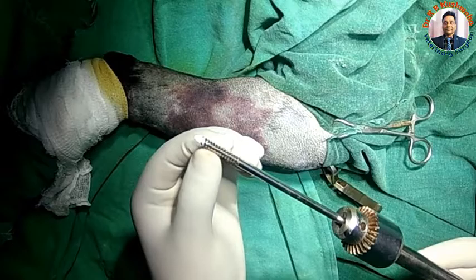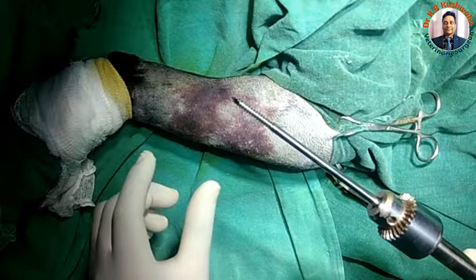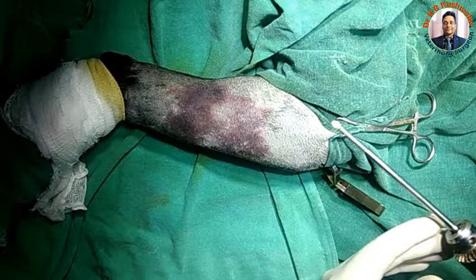This is the end-threaded pin — you can see here the end is threaded. The advantage of putting an end-threaded pin is that it anchors in the distal segment properly and does not back out; it moves in only one direction.